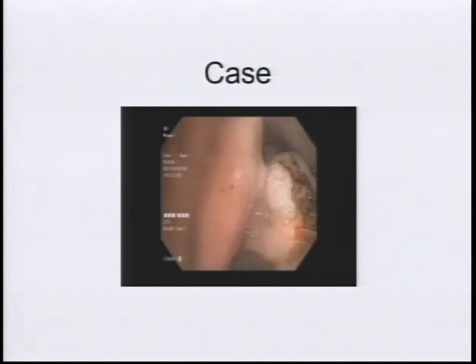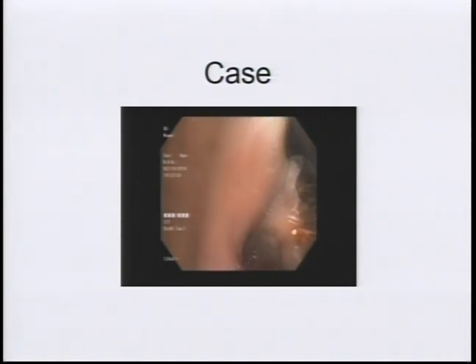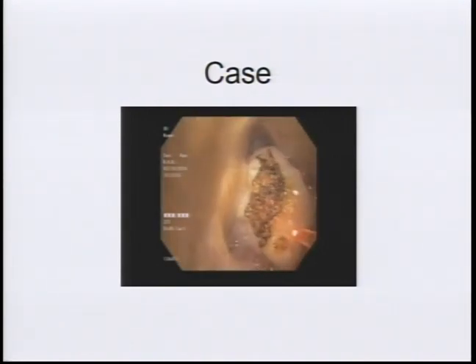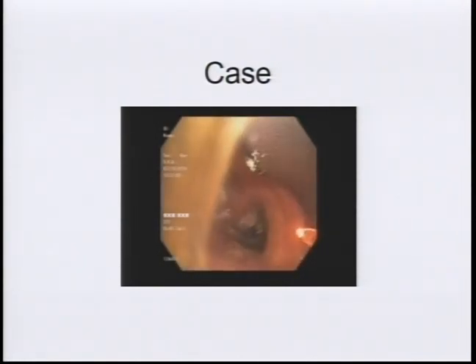So in addition to laser, which is a very pinpoint, very deep type of therapy, there's a different kind of heat therapy or cautery therapy, which is called argon plasma coagulation. That one is more superficial. It's not as directable as this one, which is kind of like a little pen where you can direct it exactly how you want it, and you can also adjust the power of the laser to improve the depth of penetration. Now this requires that your FiO2 during this time be below 40%, ideally below 30%, so that you don't ignite an airway fire.